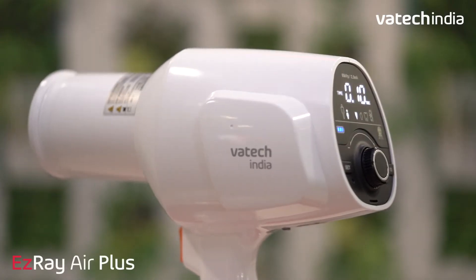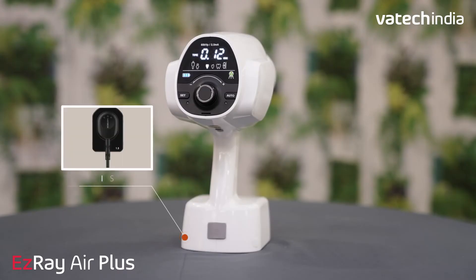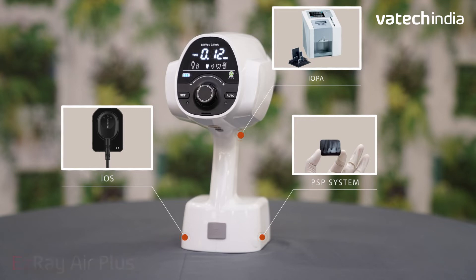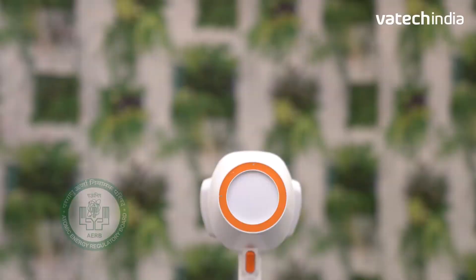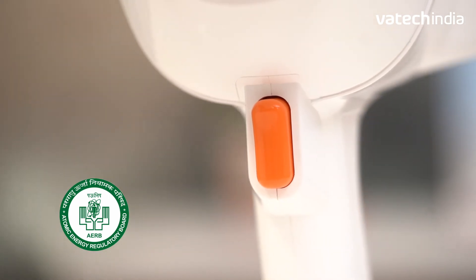Packed with multiple smart features, EZ-Ray Air Plus offers improved compatibility with all types of iOS, IOPA and PSP systems with wide exposure time, making it the best solution for your digital imaging requirements. The unit is AERB approved and certified for all safety standards.